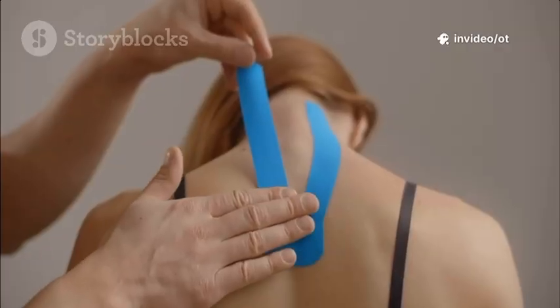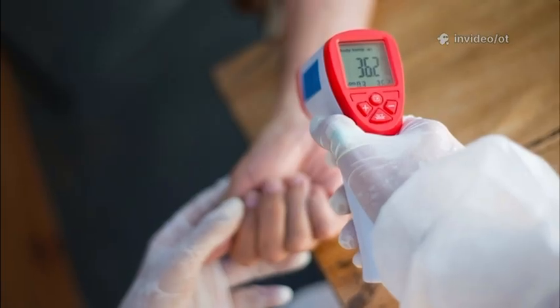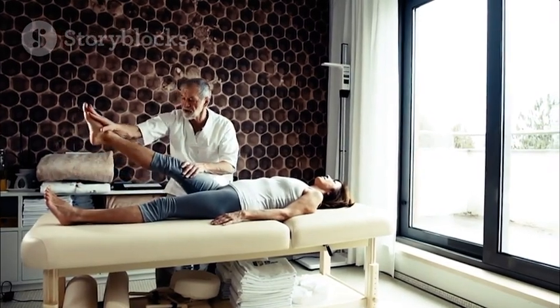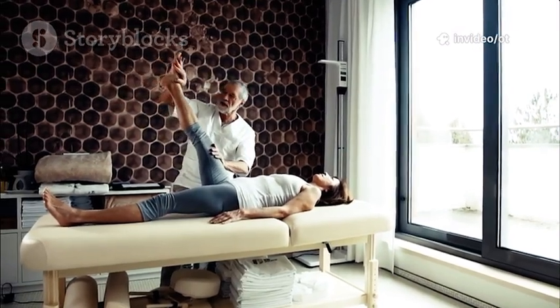Wrap a hydrocollator pack in 6 to 8 layers of toweling. Aim for skin temperature around 40 to 45 degrees Celsius. Comfortably warm, not painful. Treat 15-20 minutes, check skin at 5 minutes, and use the final 5 to 10 minutes for gentle ROM or stretching.